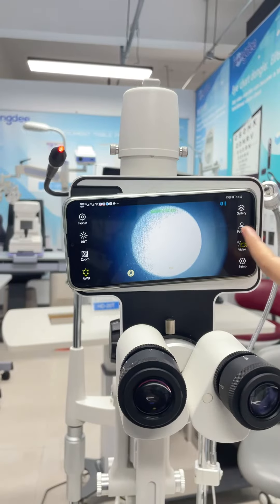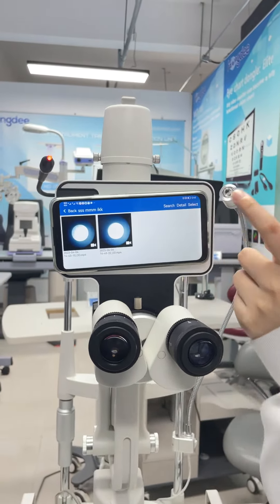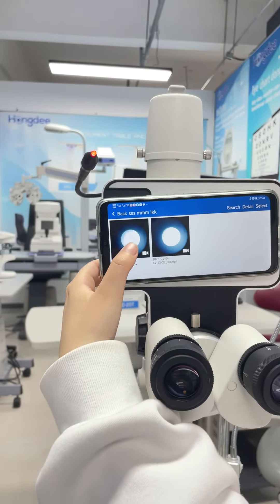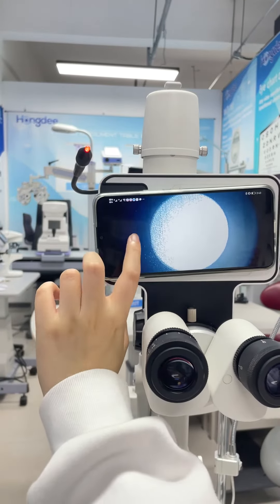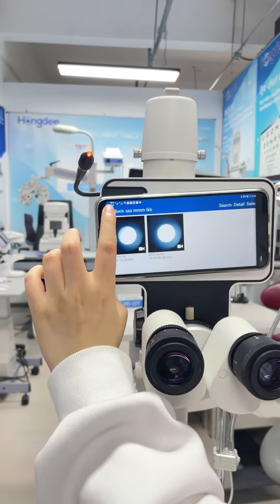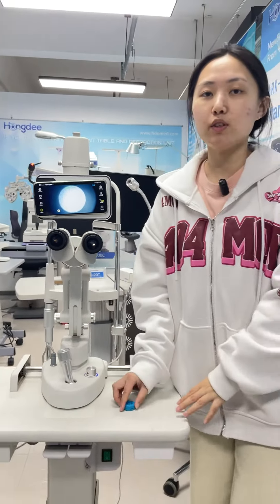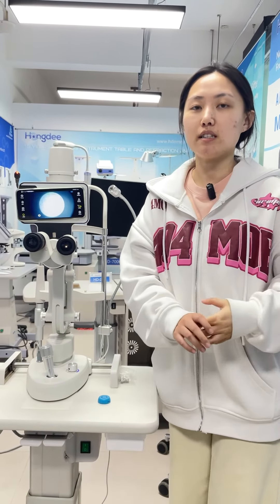Now we can press this gallery. There are the video and the photos. It's very simple and convenient. If you are interested in our slit lamp imaging model photo, just leave your contact information. Thank you.